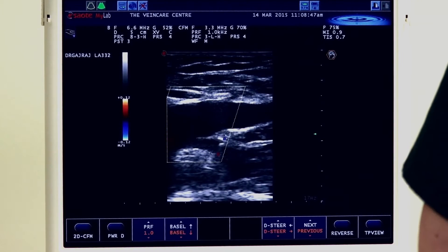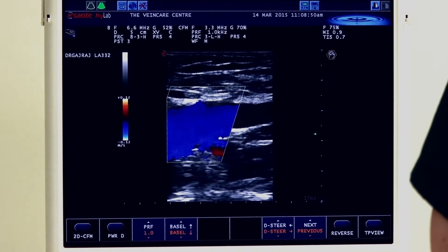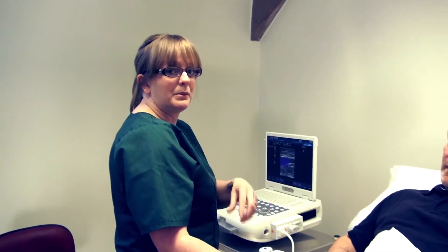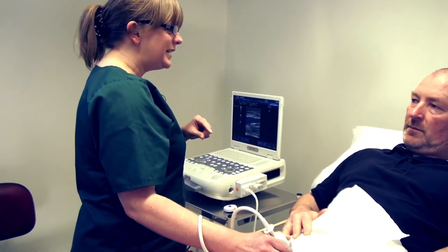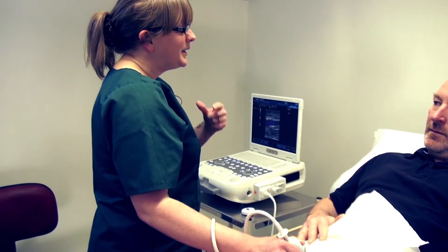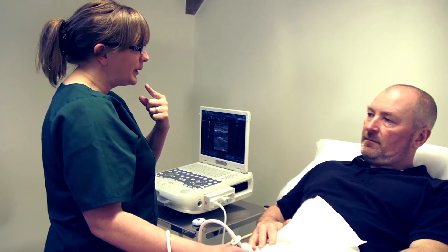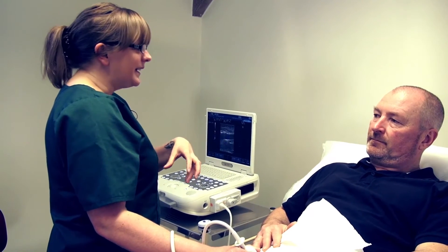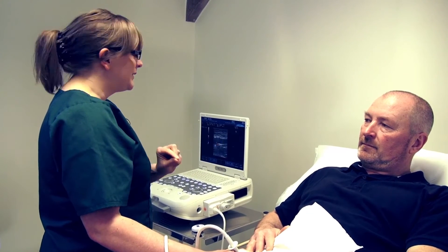You can also perform the Valsalva manoeuvre at this point. That is going to demonstrate there are no clots higher up and will demonstrate the competency of the deep venous system. I am going to get Dave to breathe in, hold his breath, keep his mouth closed, and blow into his cheeks — and bear down. That is going to stop blood flow coming back down the leg by closing those valves off.